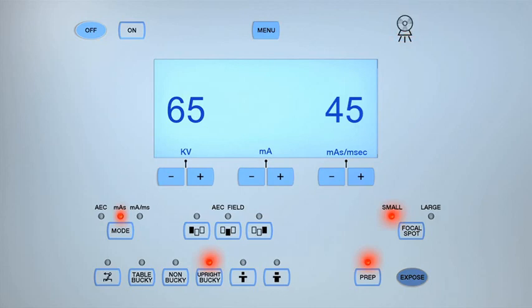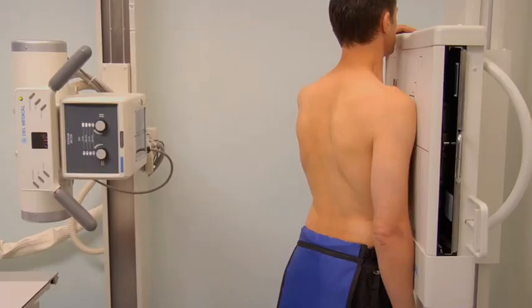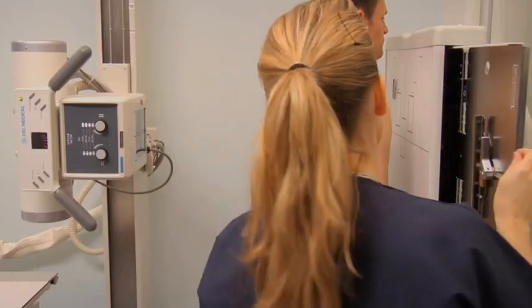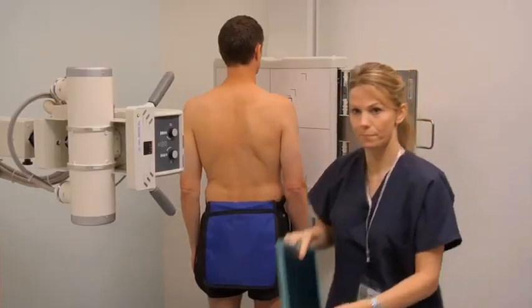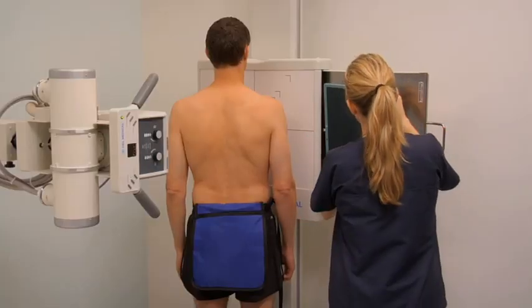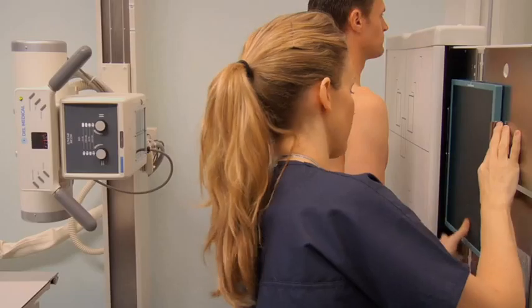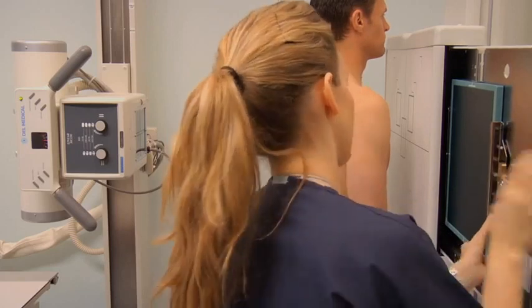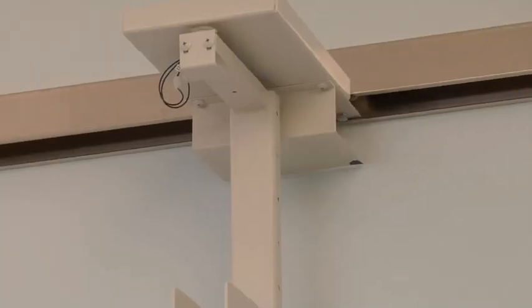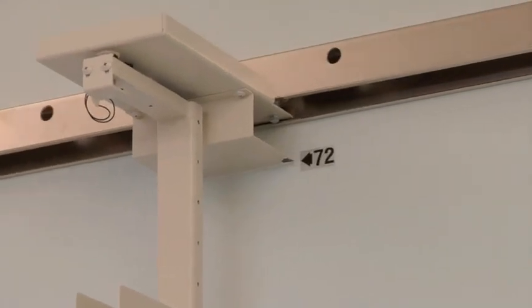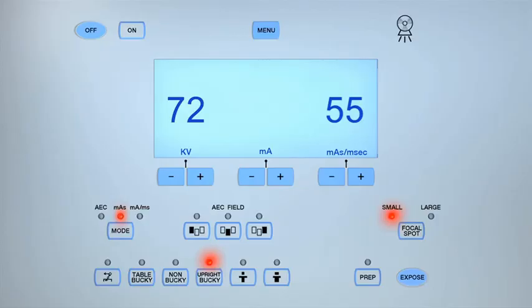Once the exposure is completed, inform the patient that they may relax and breathe normally. Remove the cassette from the bucky and process it. To obtain a lateral X-ray projection of the sternum, place a 10 by 12 inch cassette lengthwise in the upright bucky, set the SID to 72 inches, and select the appropriate exposure factors.